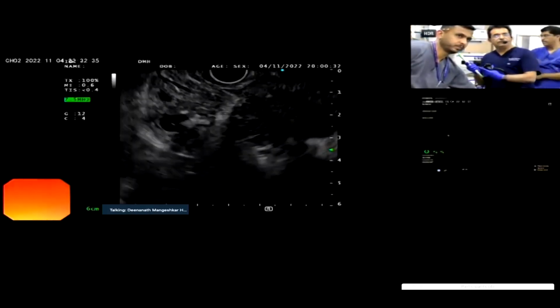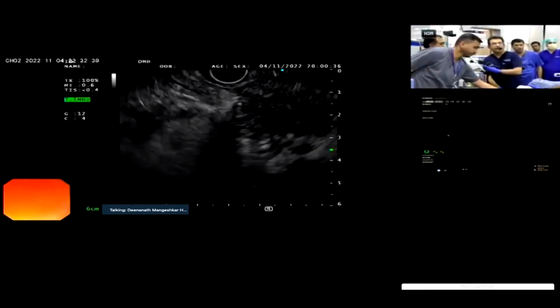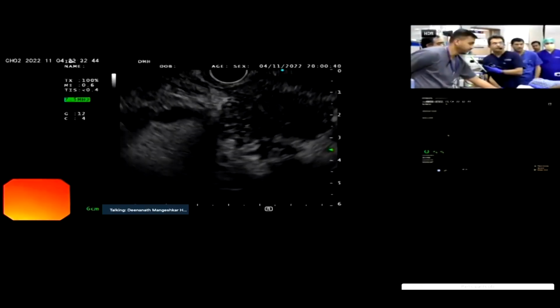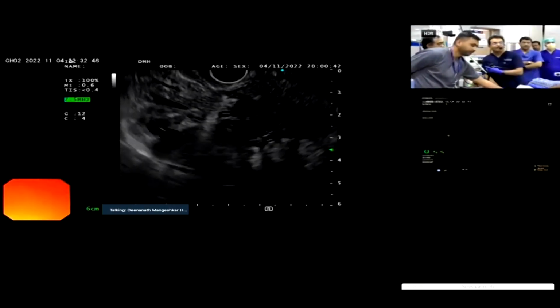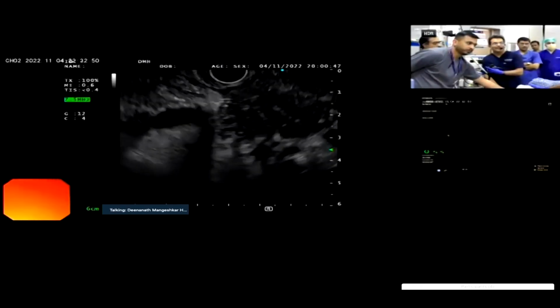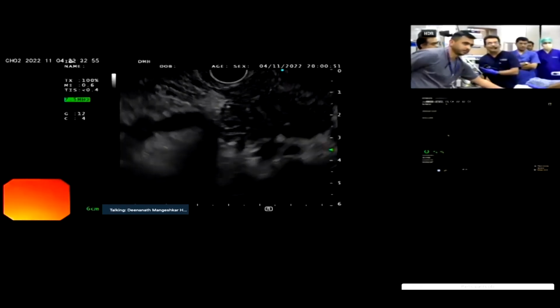So now I'm going to use the elevator. What about SMV? Yeah, I will show you that in a moment. We are running short of time, we have to show 4 cases. That's the reason I did not waste too much time, but I will try and show it to you after the first pass is over. Okay?